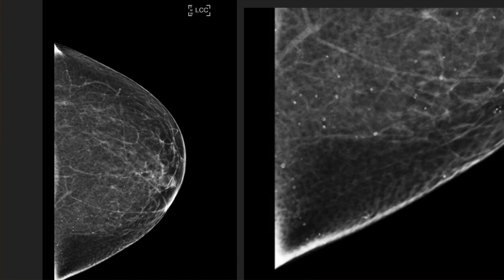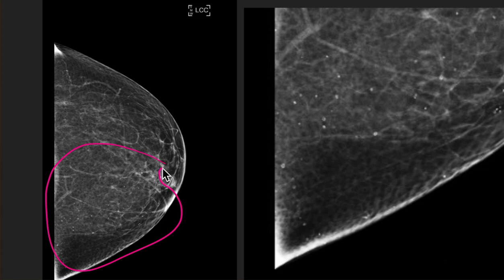Here's a different patient. In this case they are more scattered, so they wouldn't be particularly concerning anyway. And again, on the screen magnification view, you can see that many of these are lucent-centered.